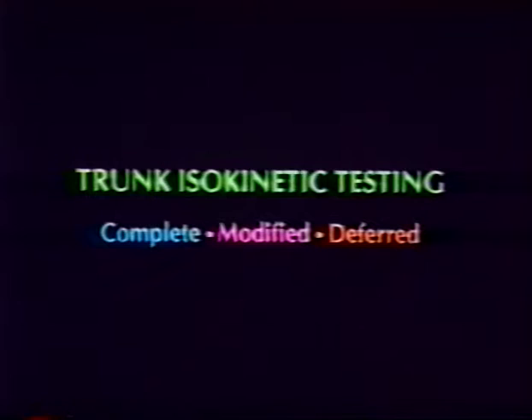If isokinetic testing is indicated, the clinician may perform a complete isokinetic test consisting of a variety of speeds at maximal effort, or a modified test protocol which includes limited speeds and intensity according to the limitations of the patient. If necessary, the clinician may determine to defer the testing to a later date.